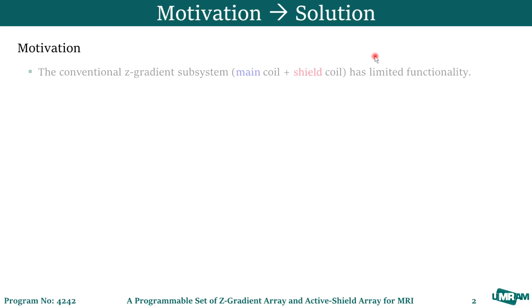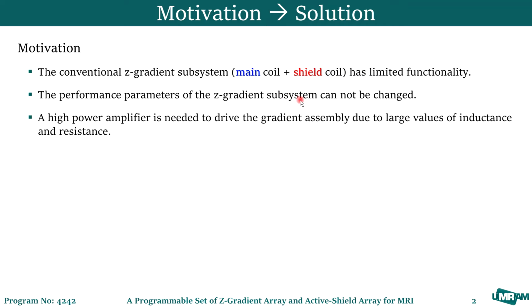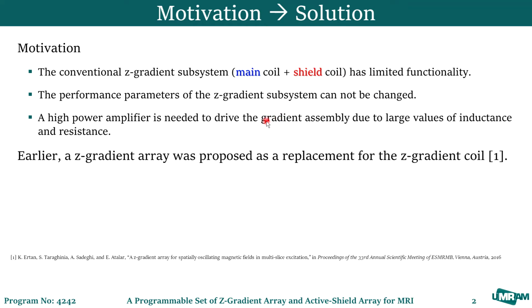The motivation is that the conventional Z-gradient subsystem, consisting of the main coil and the shield coil, has limited functionality. The performance parameters of the Z-gradient subsystem cannot be changed, and a high-power amplifier is needed to drive the gradient assembly due to large values of inductance and resistance.